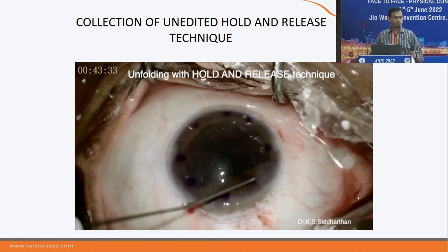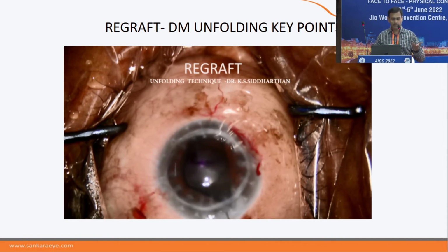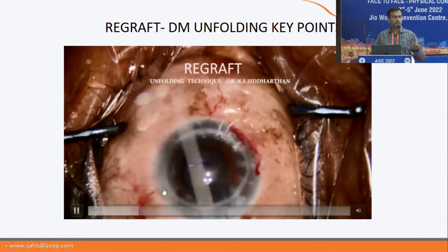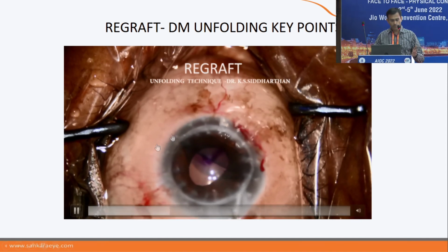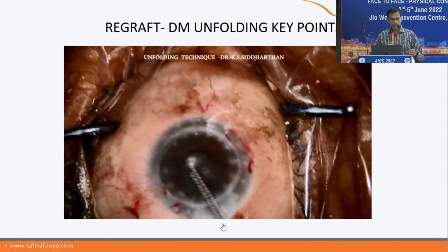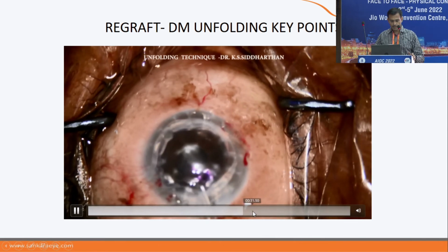So these are the few techniques. And one more thing is, in regrafts, what I've learned is, always try to take a graft size lesser than your graft host junction. Don't go for a bigger one. In initial cases, I took a bigger one. It's very difficult to unfold. Also, the graft host junction is irregular, so it will not stick properly, and post-operatively you will have problems. In initial cases, I took a larger graft as usual, how you take in regular cases, but found it really difficult. So this is another case I'll show you.